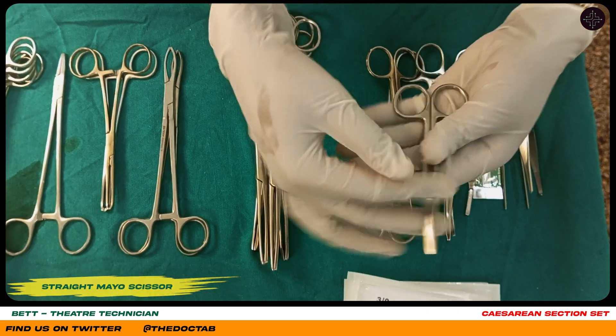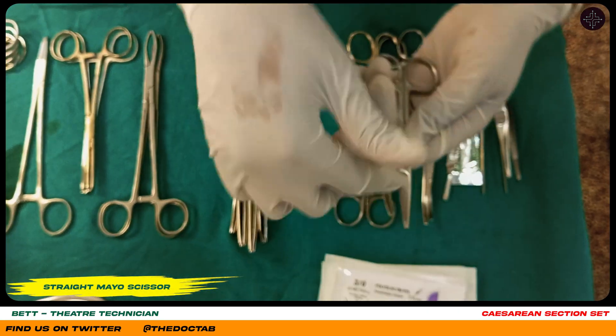Here we have a straight mayo scissor. It is used for cutting sutures.